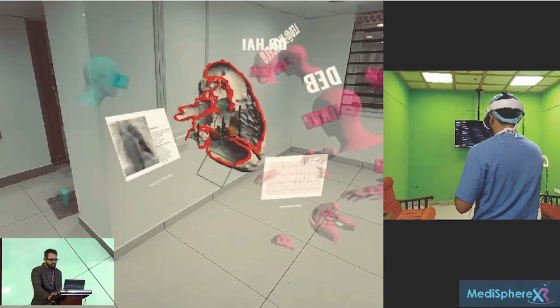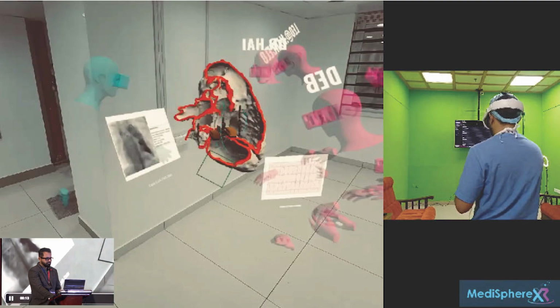If we were to even route it to the pulmonary artery, because that's also something we must consider, right? So whether we need like a 1.5. That's also in the realm of the possibilities, right? Yeah. So we did the CAT. So can you see this CAT data? I pulled it up as a banner. So the data looked okay for a single ventricle kind of a backup plan, right?